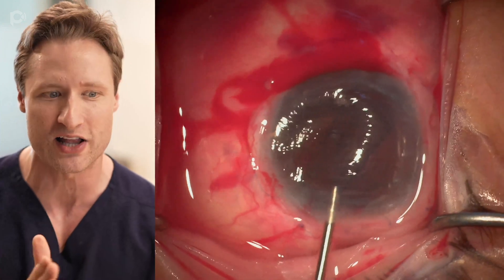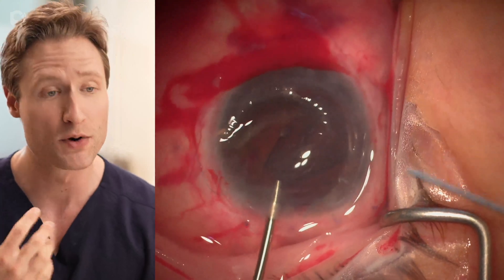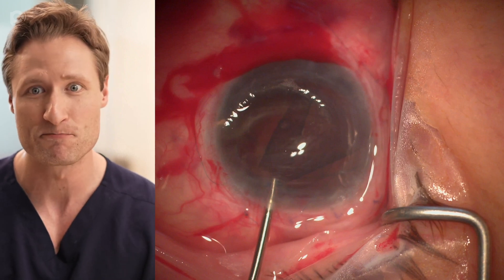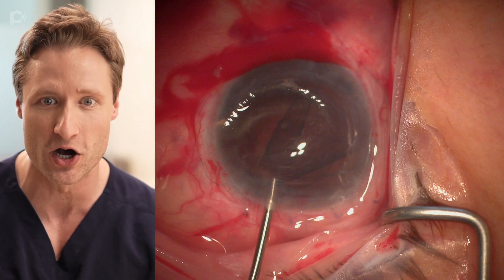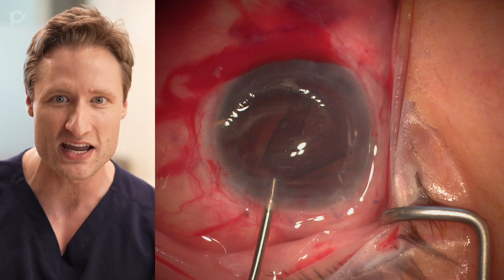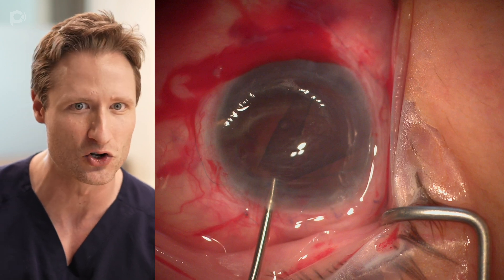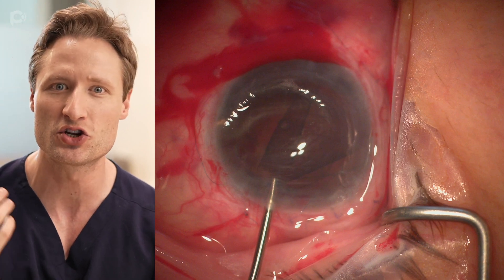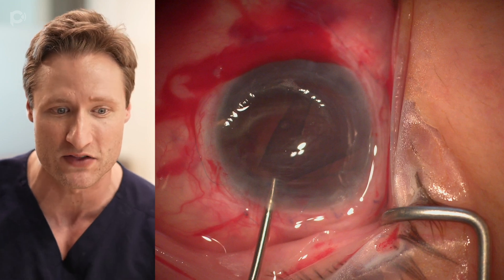Perversely, because I'm using the main wound and burping it, the eye is getting softer and that suctioning force is increasing. Now I'm telling the patient to look at the light, and as she wags around, the eye deflates even further. Mercifully, finally, I've got the graft grabbed just in the nick of time — but the eye is completely collapsed, soft, and hypotonic. A major mistake: I should not have told the patient to look at the light during that critical moment, because as they move their eye around, you start to lose control. I should have said nothing during that critical component of the operation.